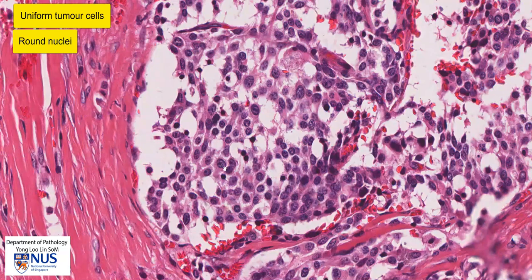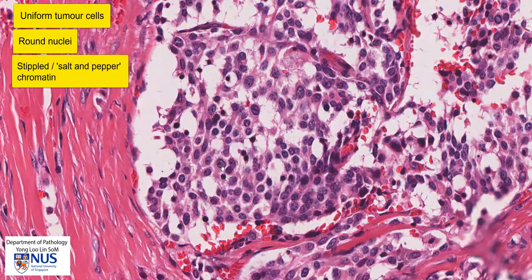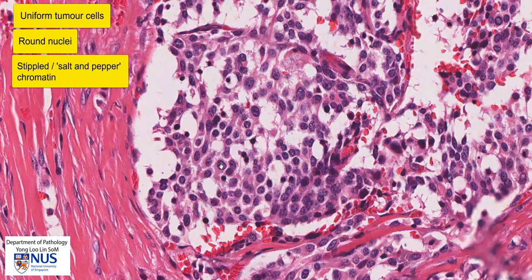Many of the cells have what we call stippled chromatin, which is quite coarsely granular. We can see that there are some bigger granules, for example here as well as here, and this is what we call salt and pepper pattern for chromatin.